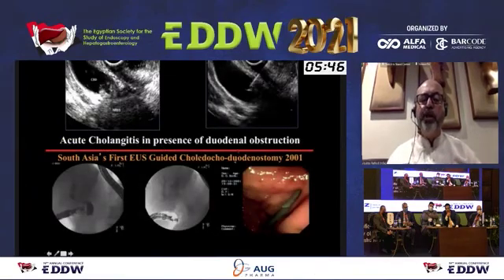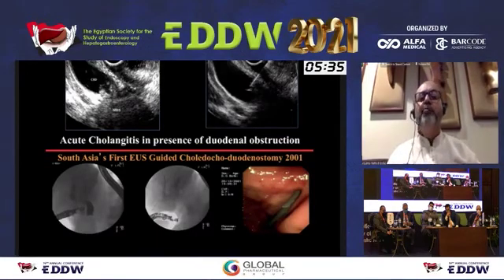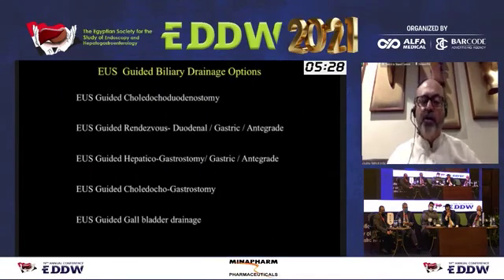This was, as I said, my first EUS-guided biliary drainage almost 2 decades back with a plastic stent, and that too was a 7 French stent, and it got blocked in some time, so we never published this. But this patient ultimately had to have a percutaneous tract or plastic stenting in those days.